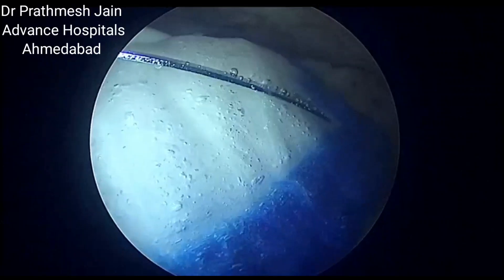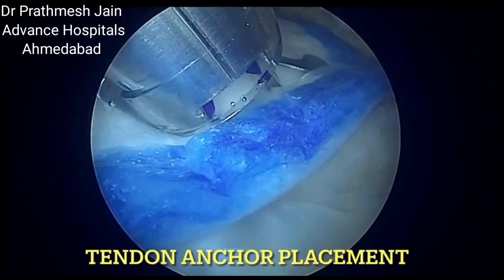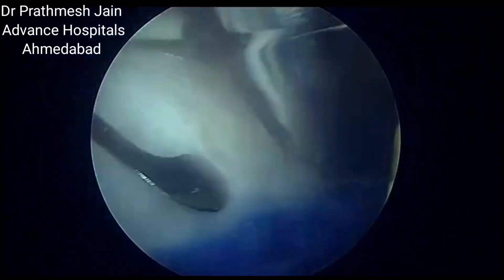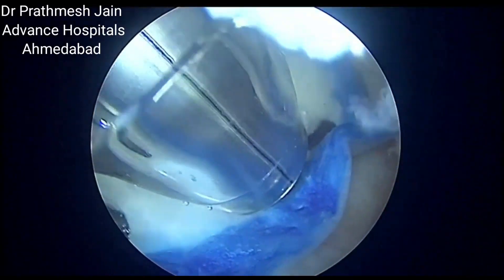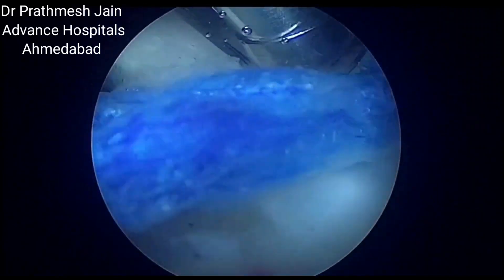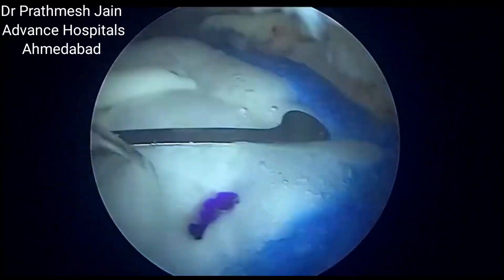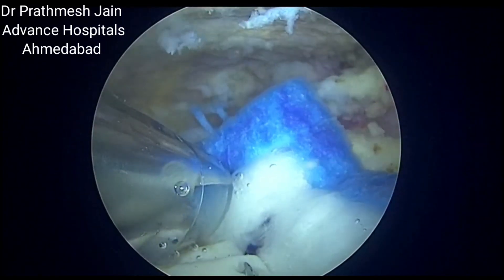Once we are sure about the position, we need to place the tendon anchors. Tendon anchors are bio-absorbable anchors which hold the patch onto the tendon. They are heat sensitive and hence need to be stored via cold storage.